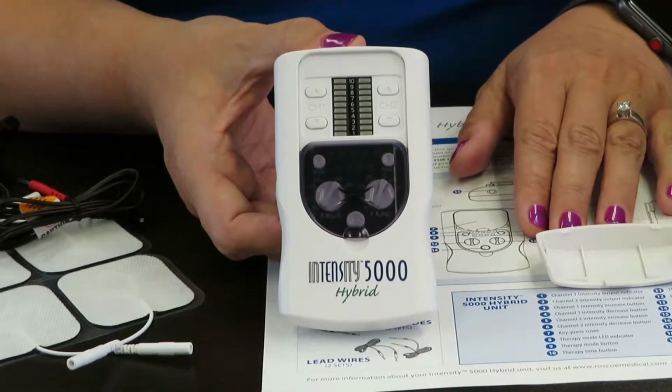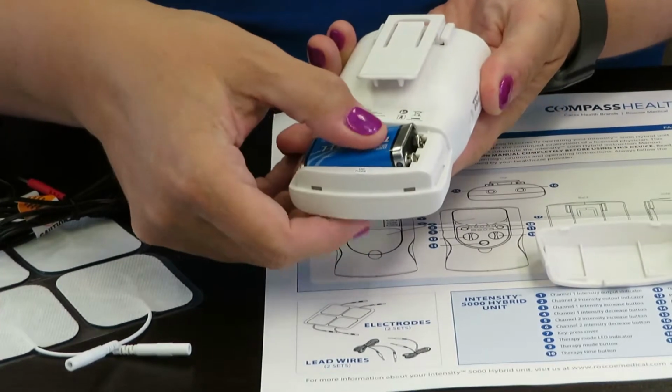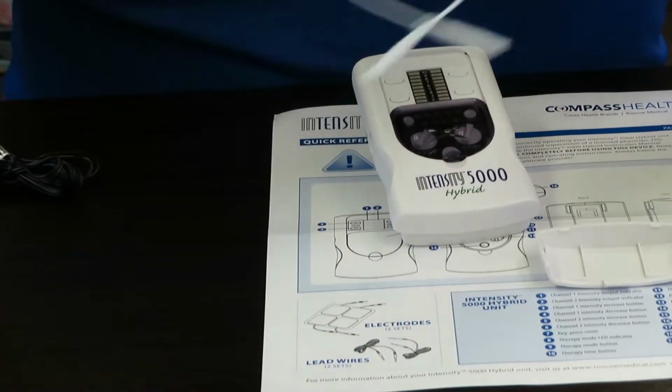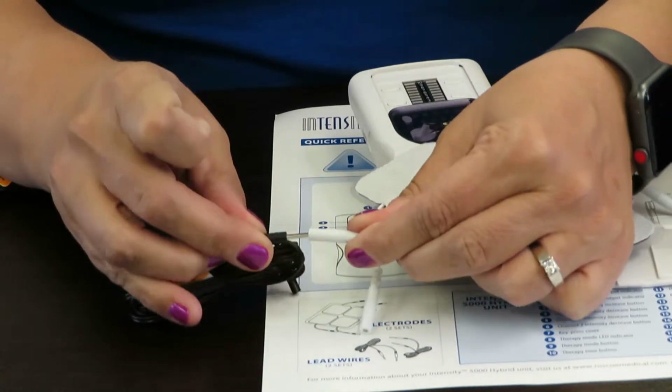Your unit comes with a 9-volt battery, which is inserted in the rear compartment. We are now going to connect the lead wires to the electrode pads. Be sure to push them in completely so they are not showing any of the metal pins.